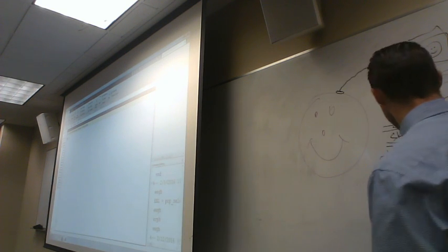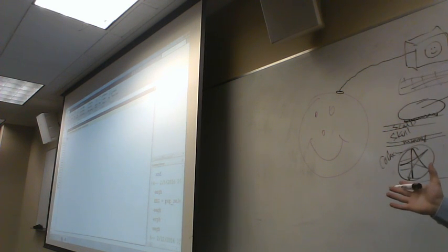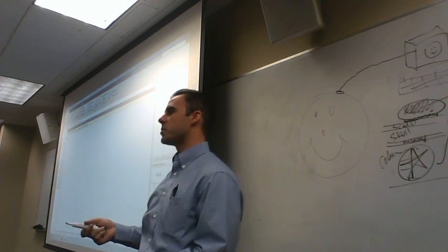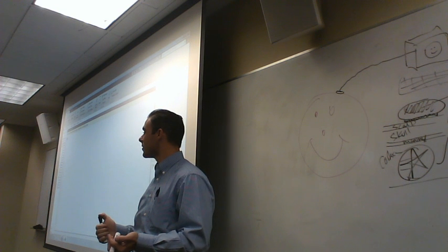So remember, this is our cortex. This is where all the action's happening. This is where all the magic happens. It's like cribs. Everything's happening here in the cortex. That's what we care about. We don't really care about this stuff. This gets in the way. This is impeding our signal. We'll call impedance later on when we record data today. So this electricity has to travel up through here and somehow get detected by this electrode. We put gel in between here, and this gel is basically a thick salt water solution. So it's just saline gel. The reason for that is because the ions of salt help to conduct that electricity.